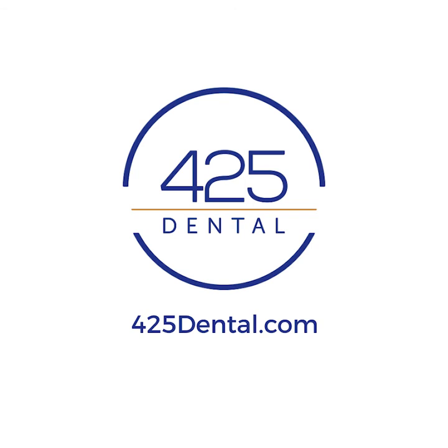Immediately after eating, please take time to brush your teeth and clean your aligners so food particles, bacteria, and sugars are not trapped on your teeth for extended periods of time. If your time is limited, take your aligners out, rinse your mouth with water, and put them back in. If you're having difficulty eating in your aligners, you can remove them, though make sure that they are only out a maximum of 30 minutes at a time.